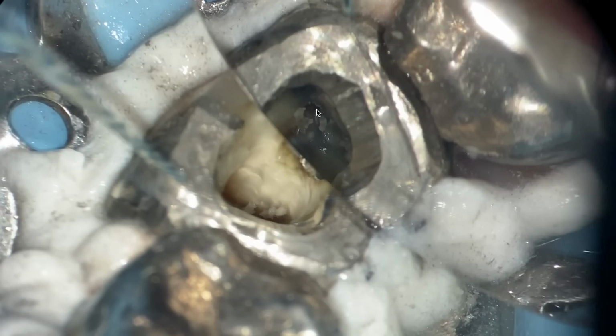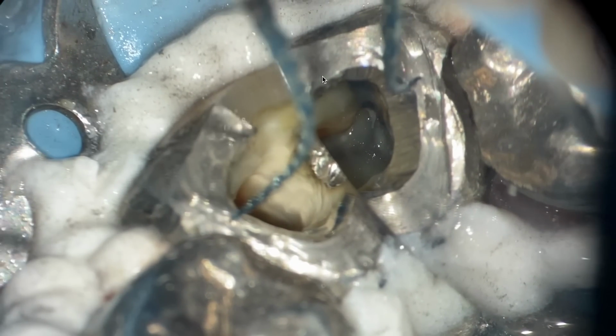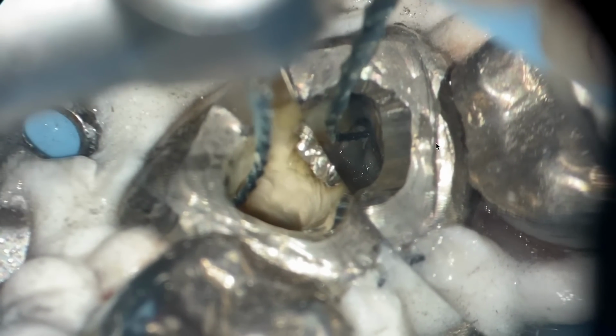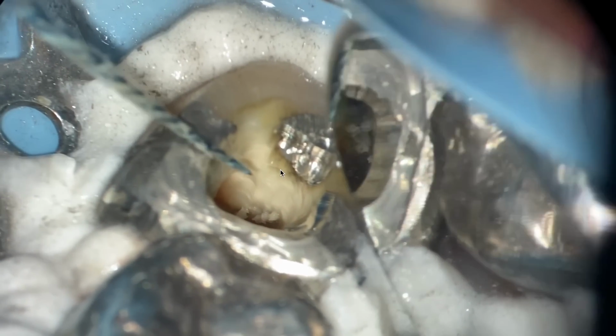Coronal 2/3 opened. And you saw that I didn't use a hand file. The reason why I did this is because it's so much easier to take my handpiece, place that file in there, and I'm able to have my mirror in the way. Then I place it in there, then I hit the gas pedal, boom, down it goes. Now, does it always go down like that? No, it doesn't. Sometimes I have to fiddle around and try to get it placed into that orifice. But I'm just going to clean and shape the coronal 2/3.